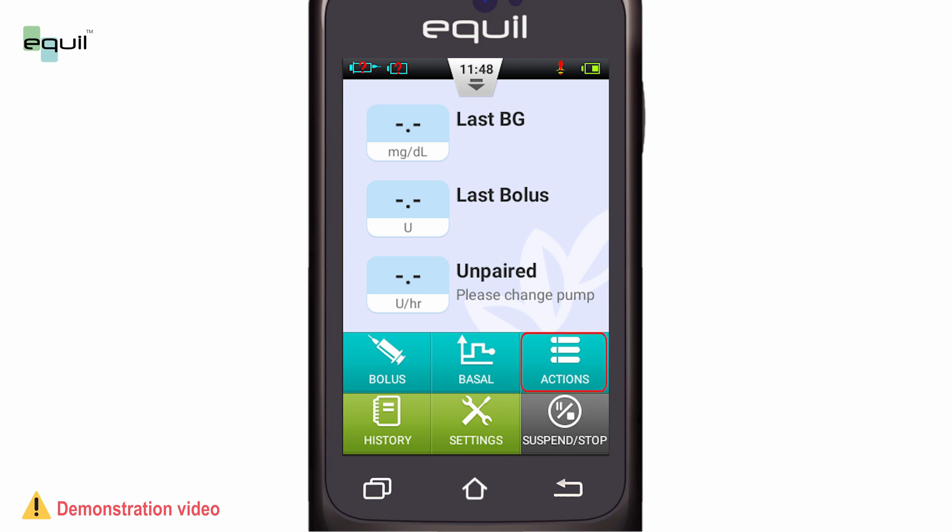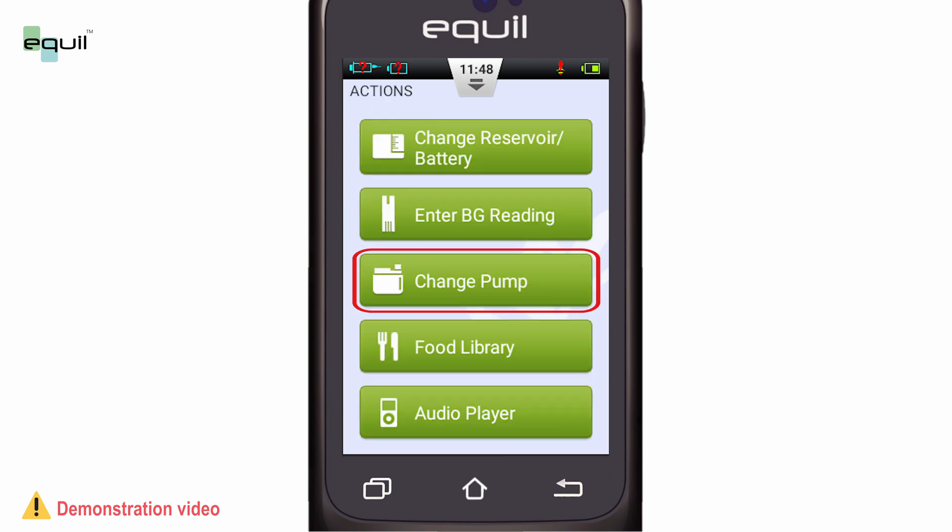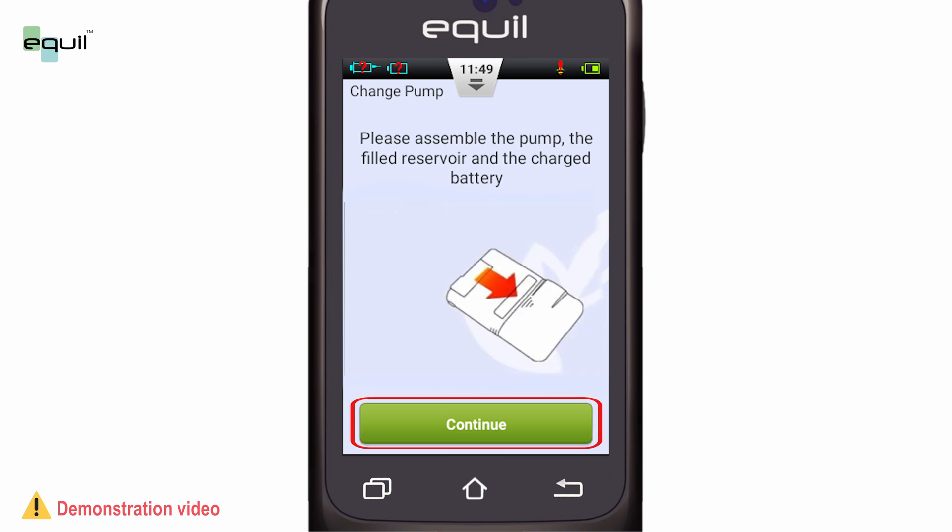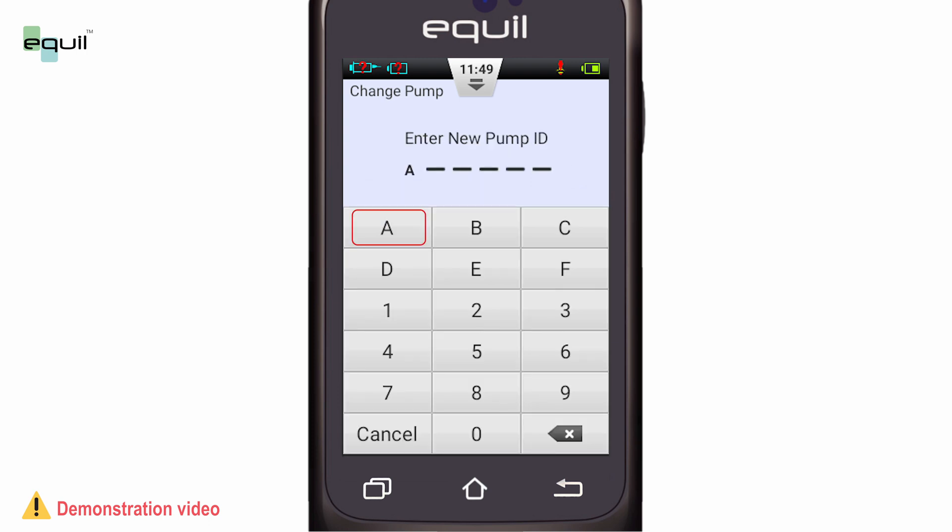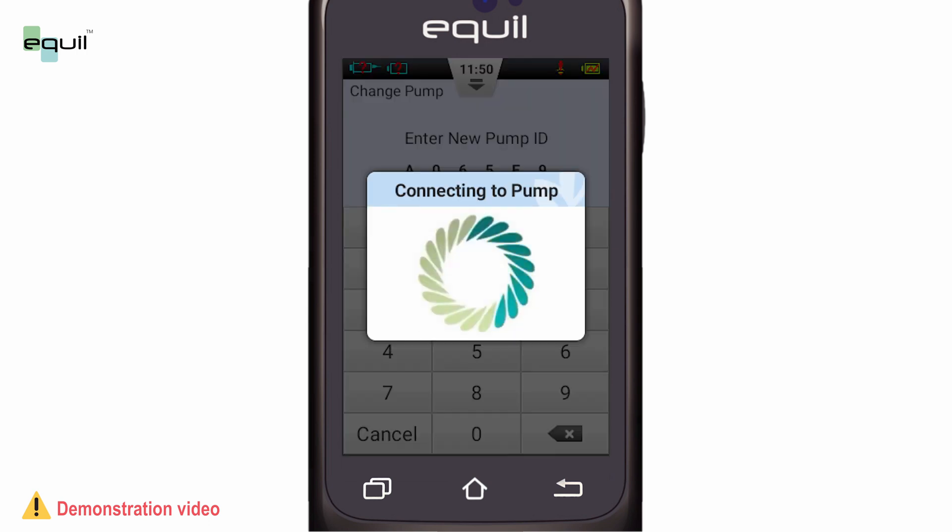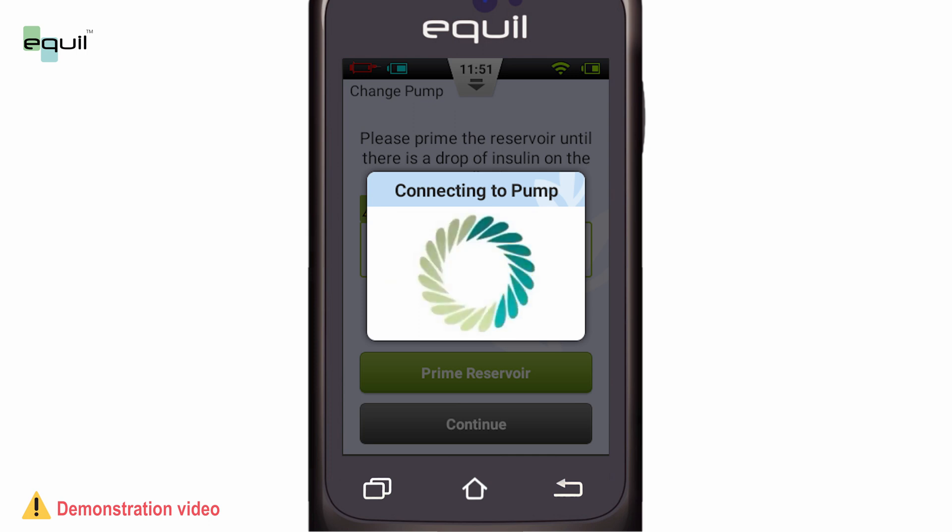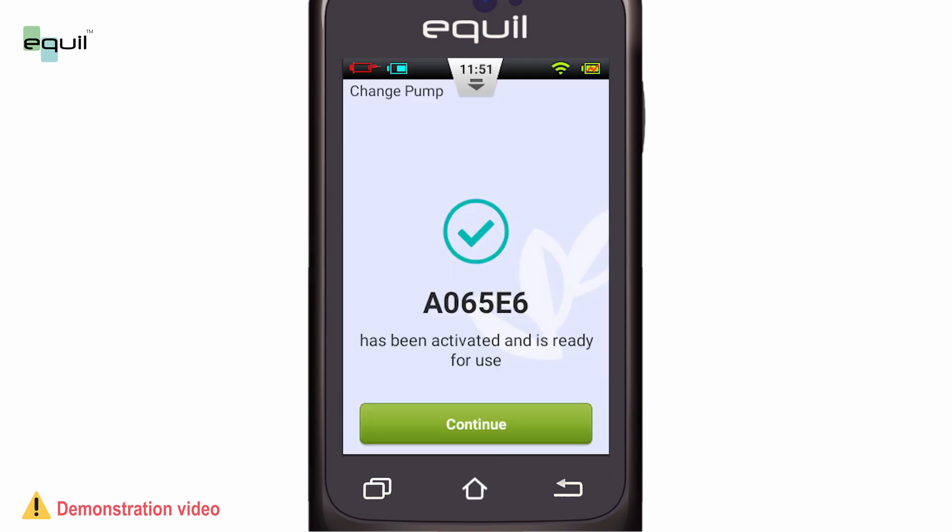Next, from the home screen select Actions, choose Change the pump and press OK to continue. Enter the pump serial number which is printed on the pump. Now the PDA will attempt to connect with the pump and you should see an animation indicating that the pump has been connected.